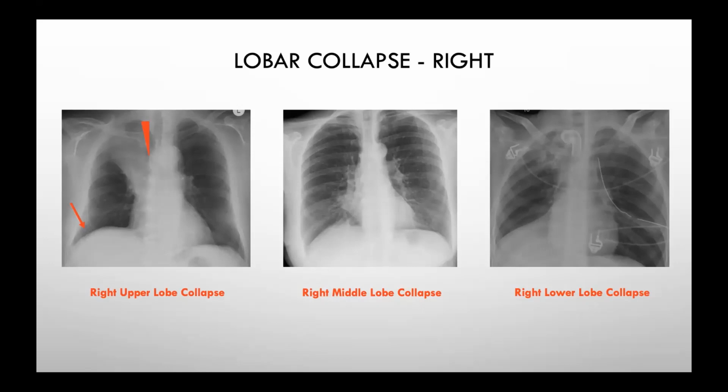And I've definitely been caught out doing a CTPA on one of these patients because the chest x-ray looked almost completely normal, and only with the consultant thoracic radiologist the next day did they say there was right upper lobe collapse on the chest x-ray. I mean, he would have needed a CT anyway, but still, it's useful to be able to pick it up.